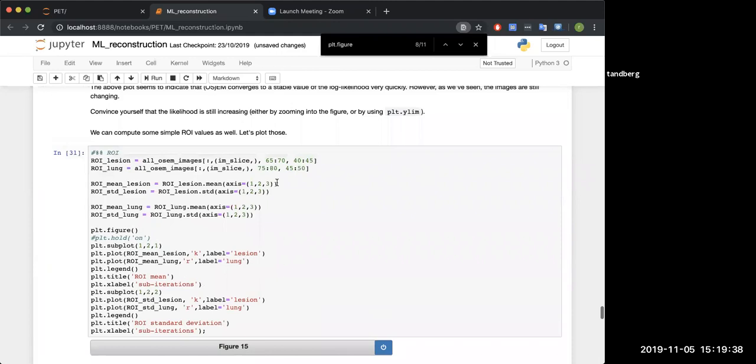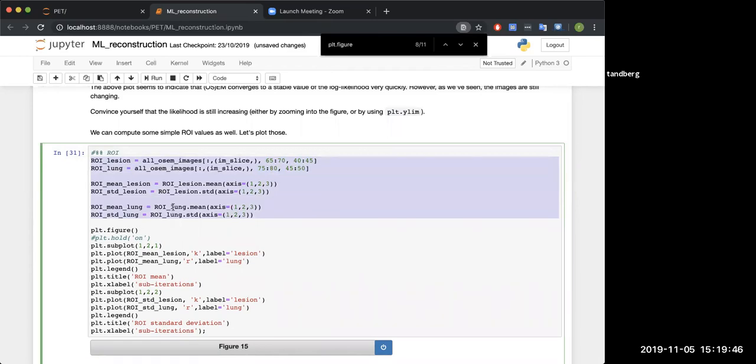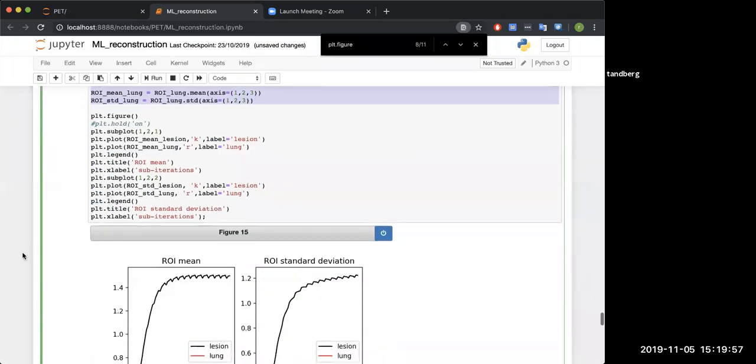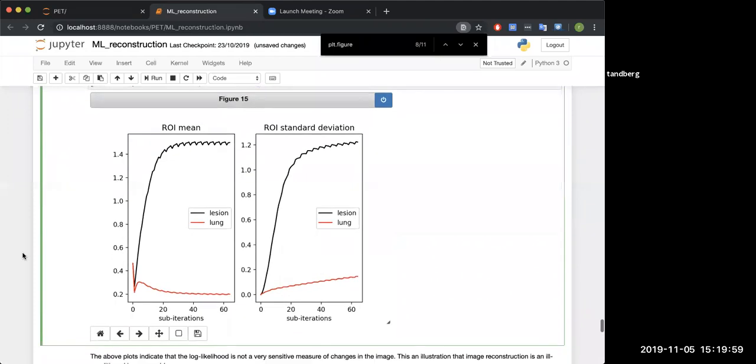In here what is going on is we're taking some areas of the image which we happen to know are inside of the lesion or inside of the lung. We're getting the values inside that ROI as a function of iteration number. If you plot that, you should have plots that look like that. Is everybody with me at this point? Does anyone need a couple of minutes to catch up?